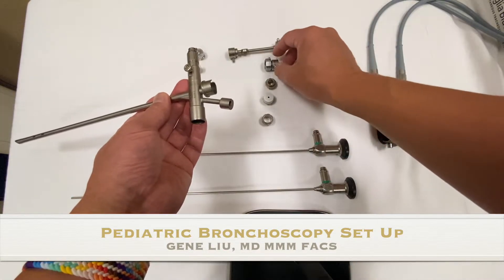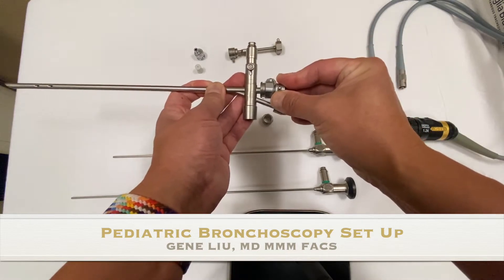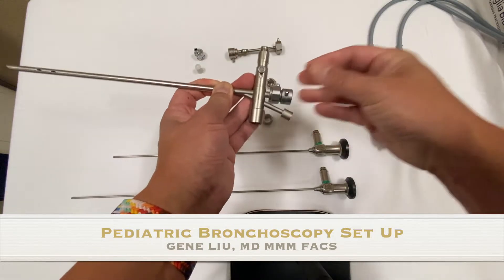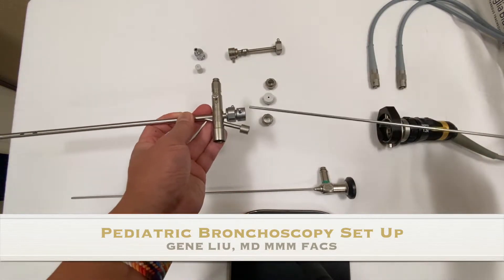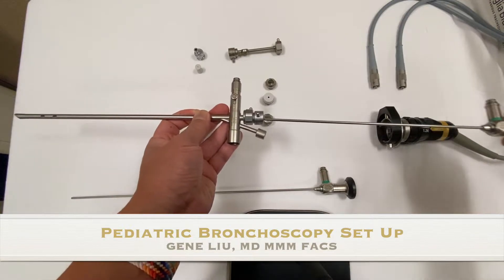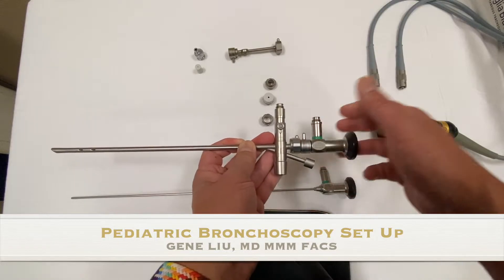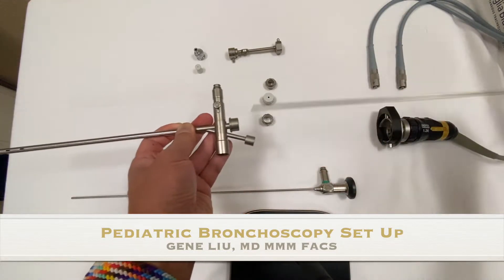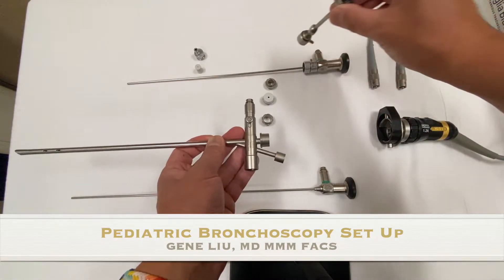The most important piece is the bridge. This is the short bridge — it attaches and clips on and allows you to secure the Hopkins rod telescope. You want to make sure you have the right length. Here we're inserting the telescope, and as you can see once we engage it and lock it, it holds everything in place and does not freely spin unlike the rubber cap. The entire array just slides out if you need to go in with other instruments.